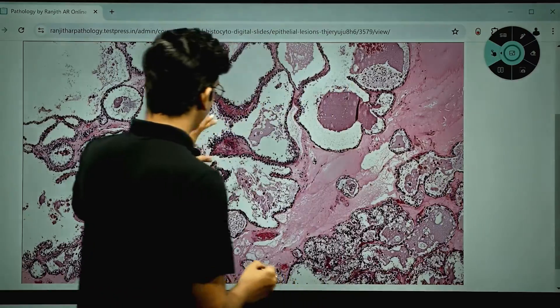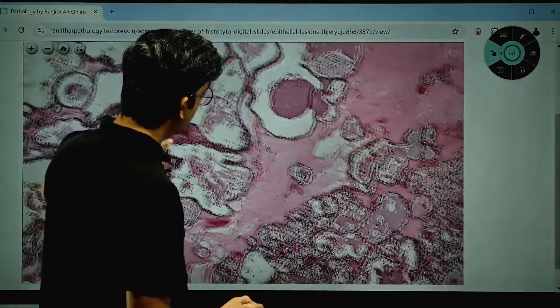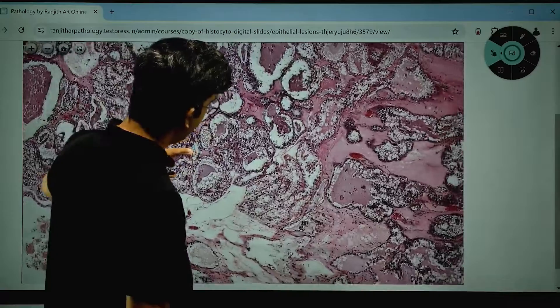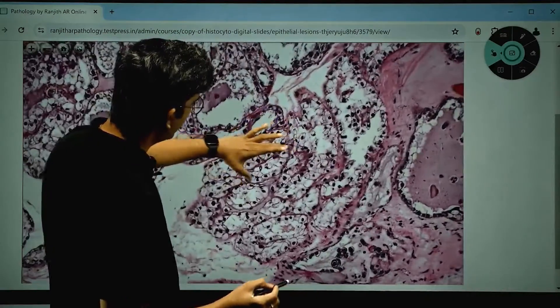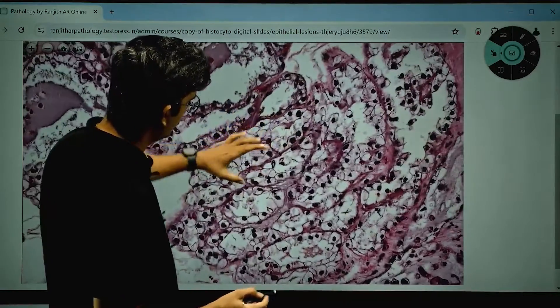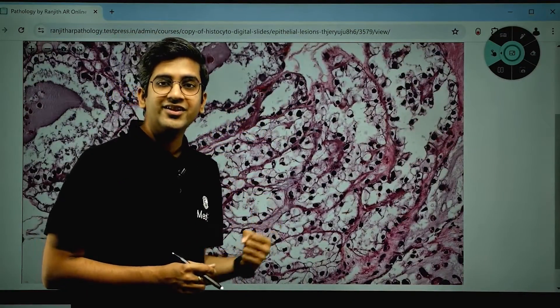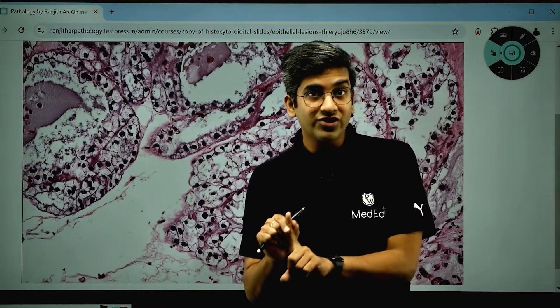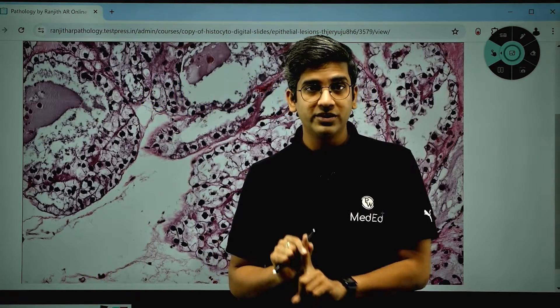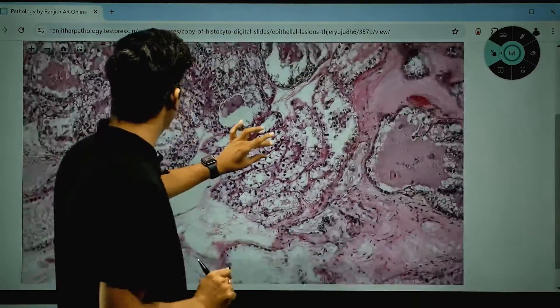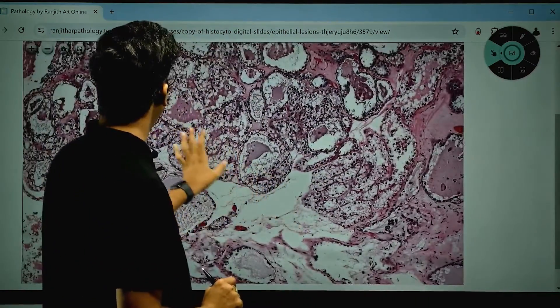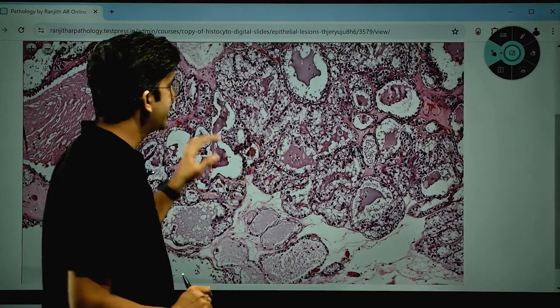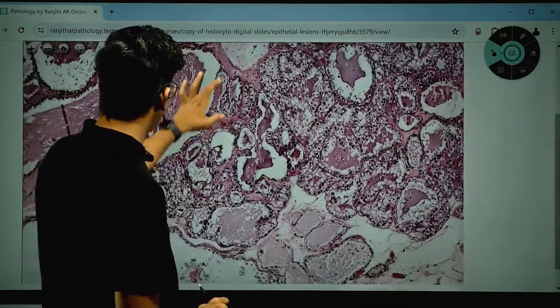Looking at the cellular architecture, focusing on the tubular areas first — zooming in, what I'm seeing is cells with a very abundant clear cytoplasm. That's one important point. But it's not just clear cytoplasm — zooming out slightly, in a few areas you can also see a little bit of pinkish, eosinophilic cytoplasm as well.